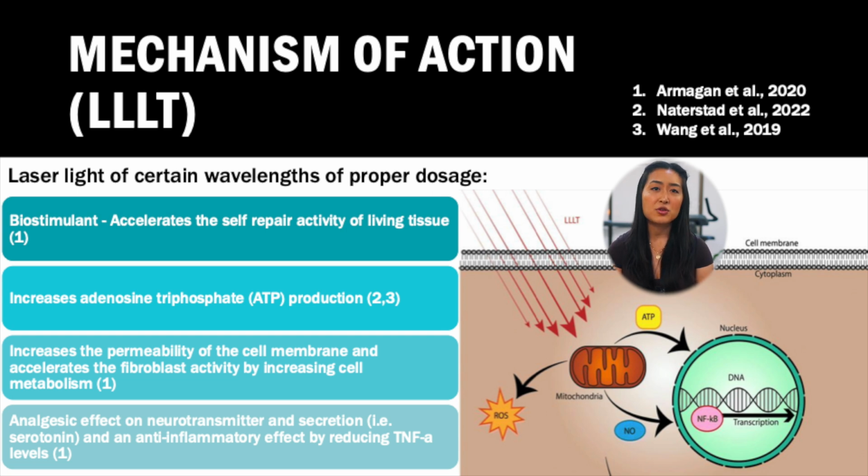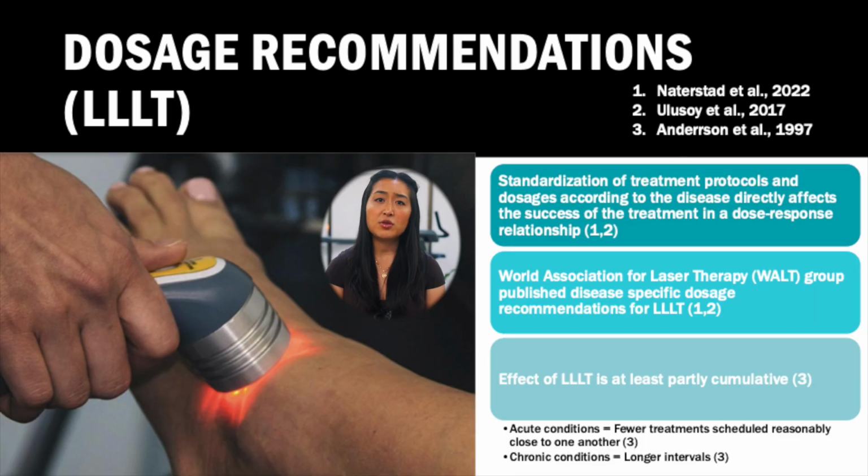Furthermore, it can have an analgesic effect on neurotransmitters like serotonin to lessen the body's pain response to the specific pathology. The dosage of laser therapy is a lot more standardized than shockwave therapy and should be much more strictly followed, because the current literature does suggest a dose-response relationship between treatment protocols and the success of the treatment. The correlation with the dose-response relationship is so strong that the World Association for Laser Therapy, also known as the WALT group, has published disease-specific dosage recommendations for laser therapy.